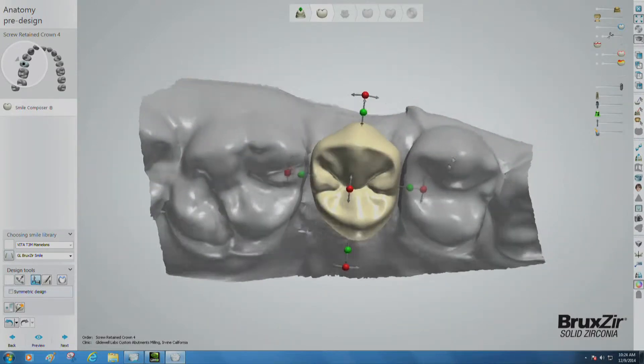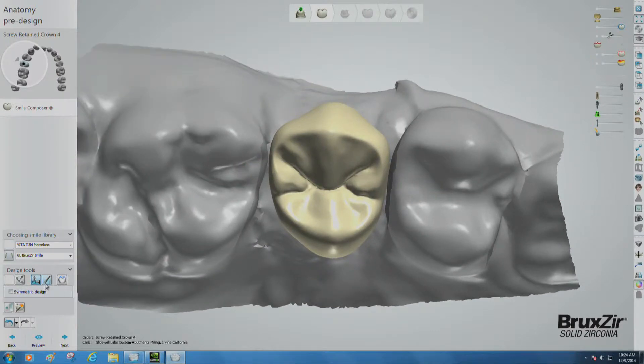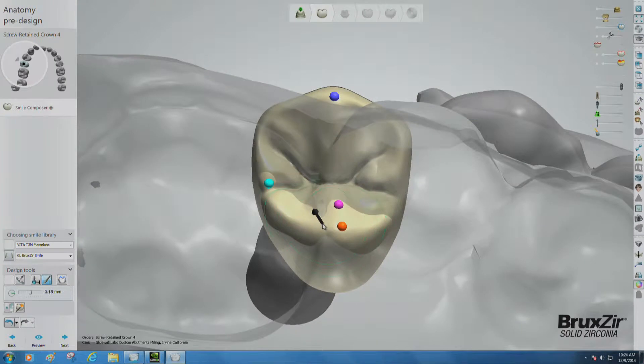When you've done all that you can with the general handles, switch to the individual morphing tool and reduce some more, section by section, until the general shape of the crown is correct.